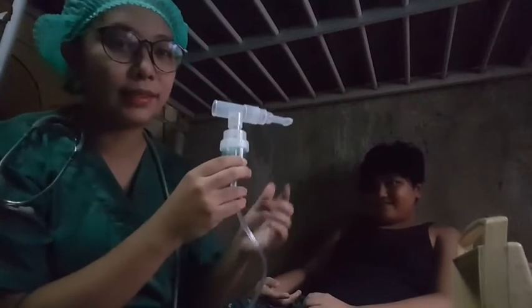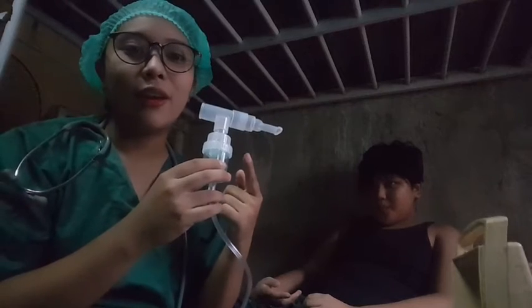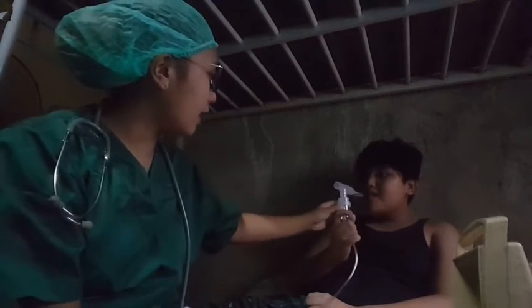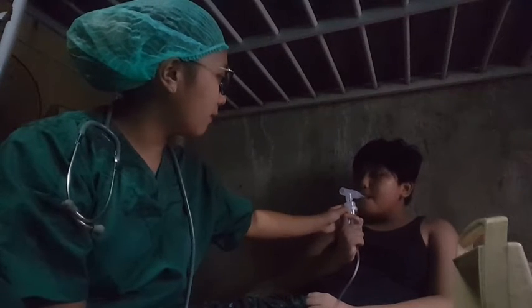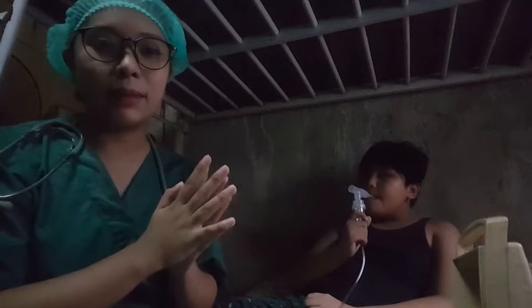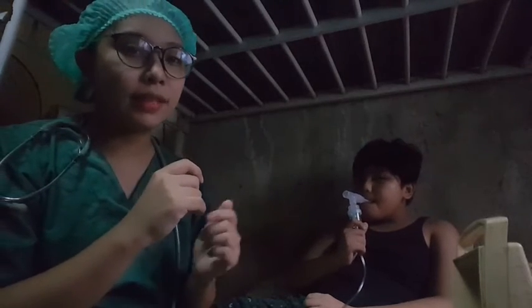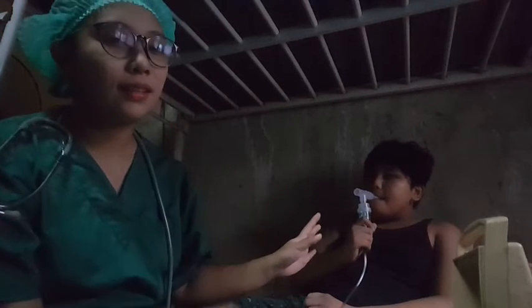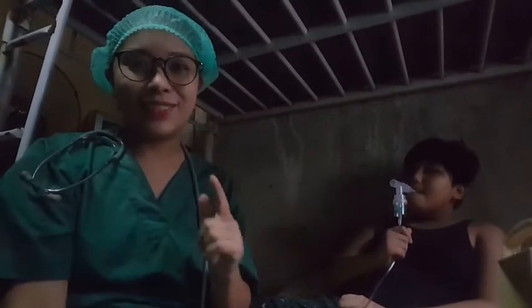Have the patient place the mouthpiece in the mouth and grasp it securely with the teeth. Okay, so grasp it all the way. There, very good. Instruct the patient to inhale slowly and deeply through the mouth, and use a nose clip if the patient is also breathing through the nose, then hold the breath and pause slightly before exhaling. Hold deeply, slowly. As he demonstrates it, we continue with our return demonstration.